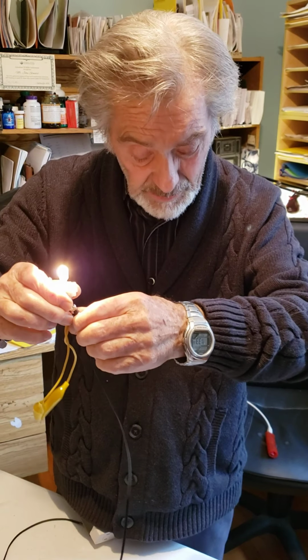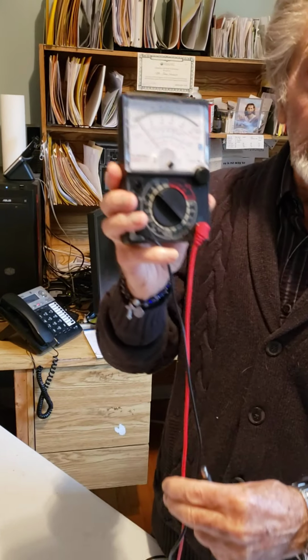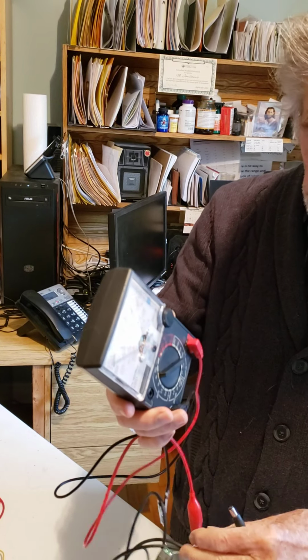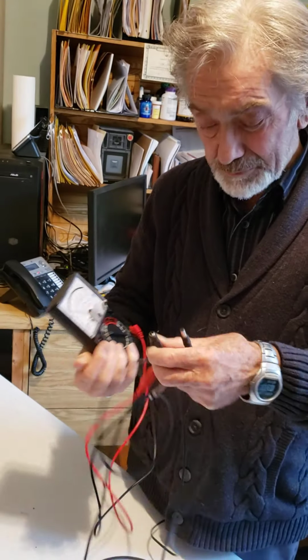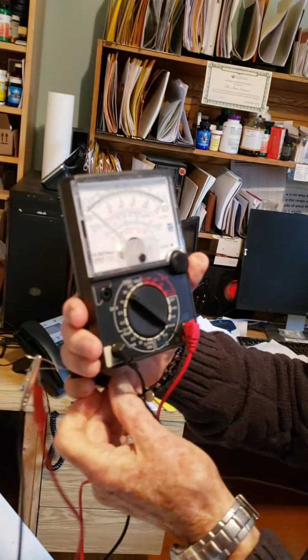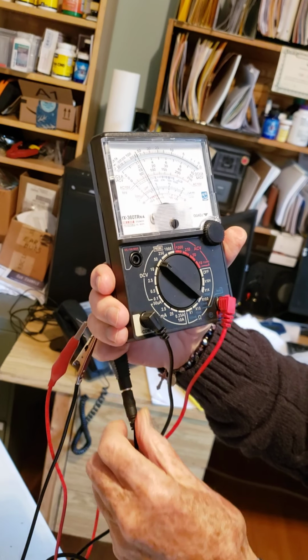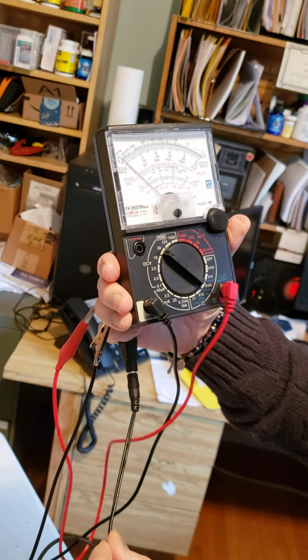Now, there's another possible way of testing using a multimeter. If you don't have my little light bulb, you can get a multimeter in Radio Shack for about $15, or even in dollar stores. So if I plug my power supply in here, you'll see I get a 12 volt reading, and I jiggle it. See how it drops down, showing. So that's one way of testing.